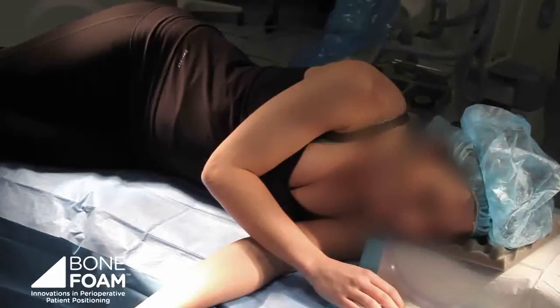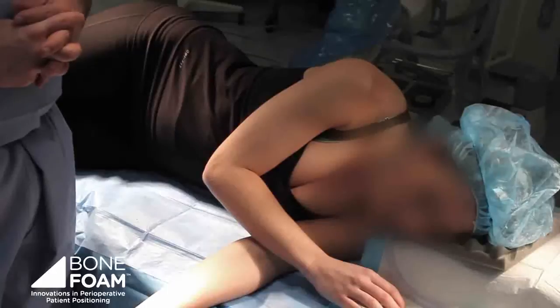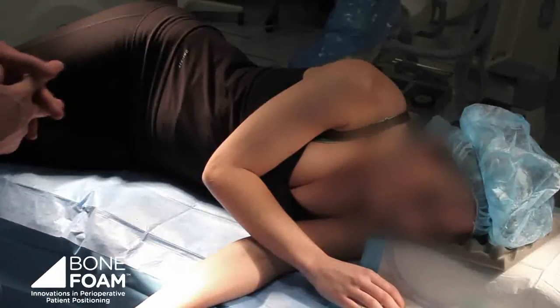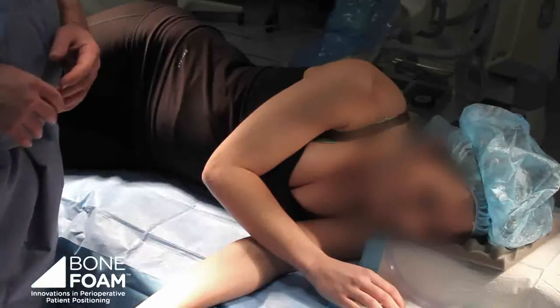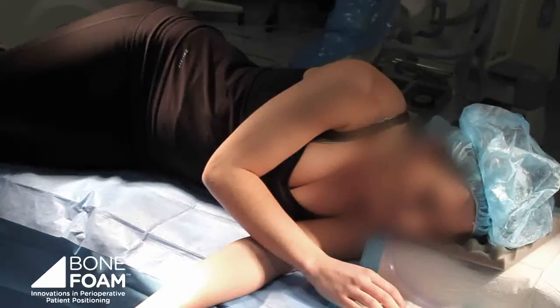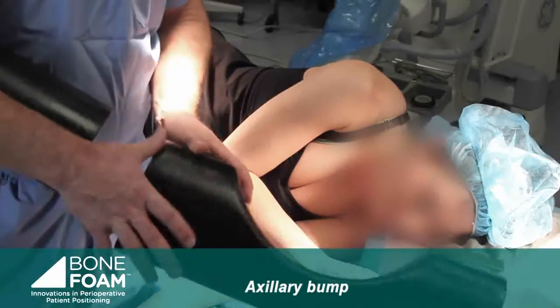I'm going to be setting up a patient in the lateral decubitus position so that we can demonstrate the upper extremity bone foam positioners. The first thing we want to do with someone in the lateral decubitus position is make sure that the axilla is appropriately protected. Bone foam has the axillary bump, which is designed to protect the axilla.